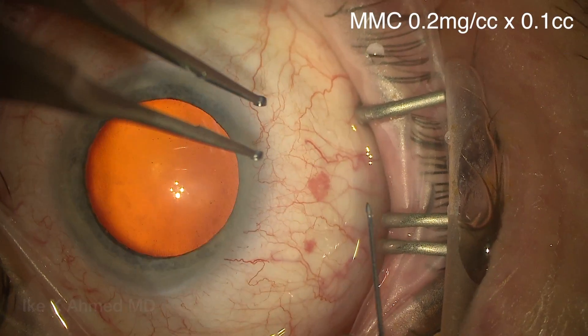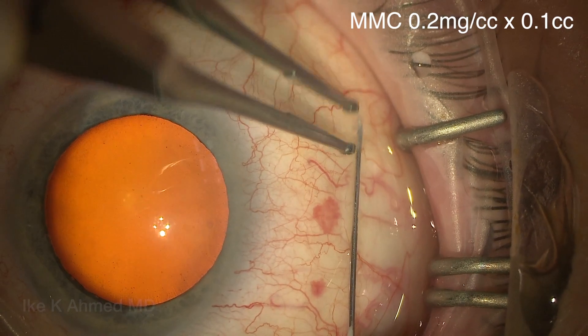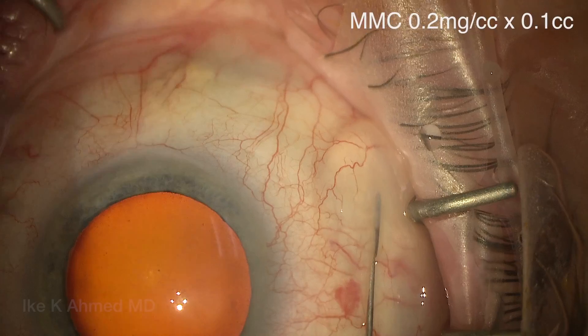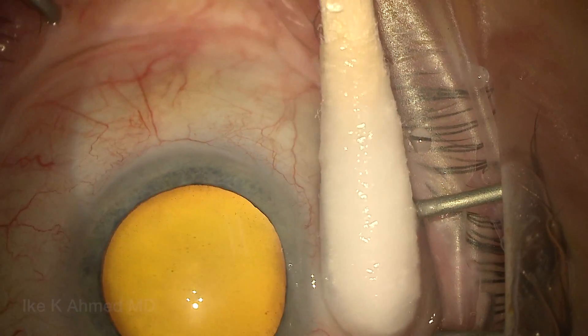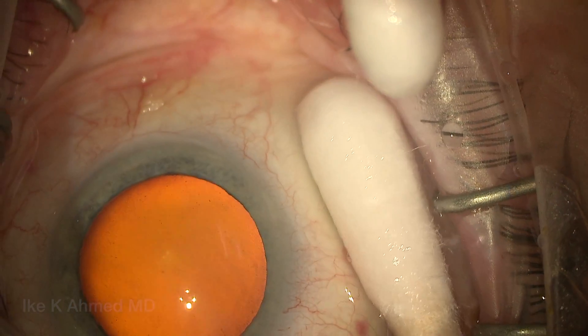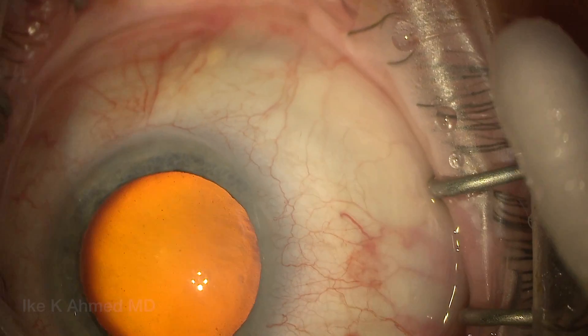This is a combined FACO-ZEN case. We'll start with the mitomycin injection on a 30-gauge needle, here being placed 6 to 8 millimeters back from the limbus, injecting an intratenon dose of mitomycin — a small dose of 0.1 cc at 0.2 milligrams per cc concentration. Having the patient look down while rotating a moistened Q-tip to keep that mitomycin back away from the limbus.